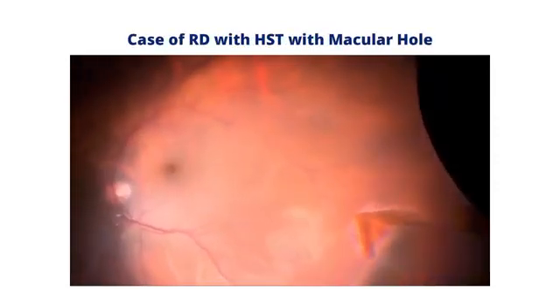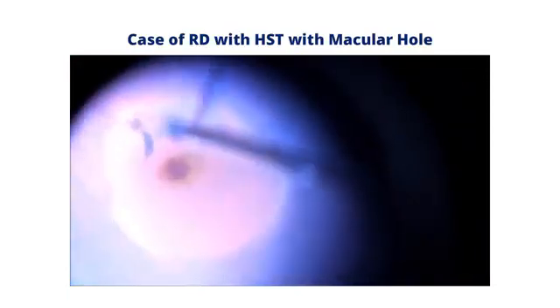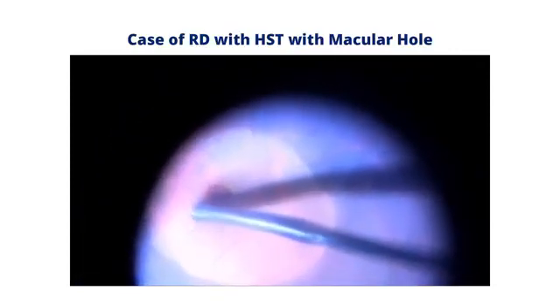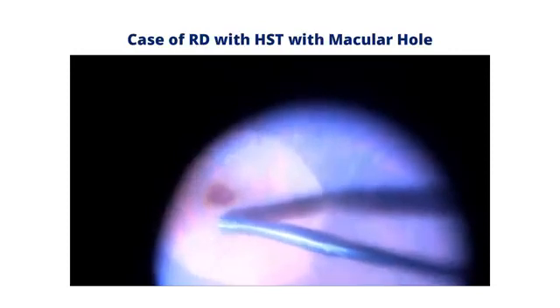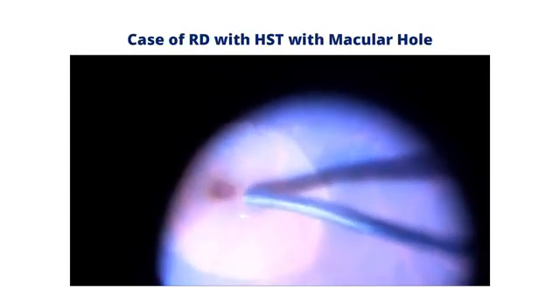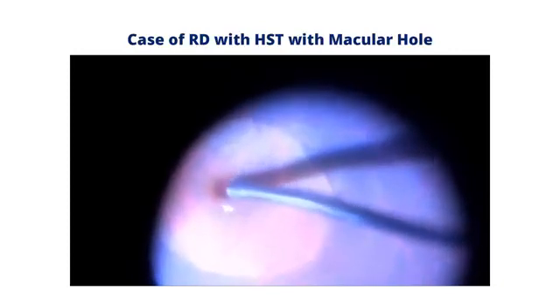Now this is a case of a retinal detachment with a horseshoe tear associated with a macular hole. So here we use a stain, but because the retina is mobile, we put perfluorocarbon, and after that remove the ILM. Once the ILM is removed, I use the massager to approximate the edges of the hole so as to release the traction. So this is being done under perfluorocarbon.